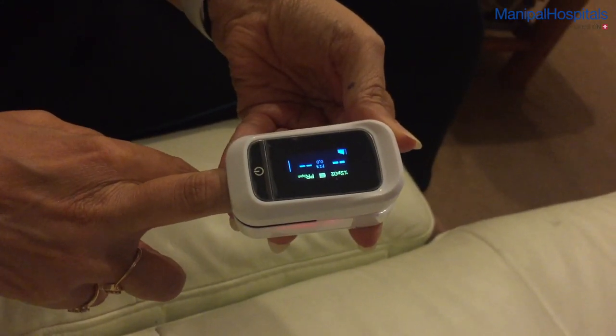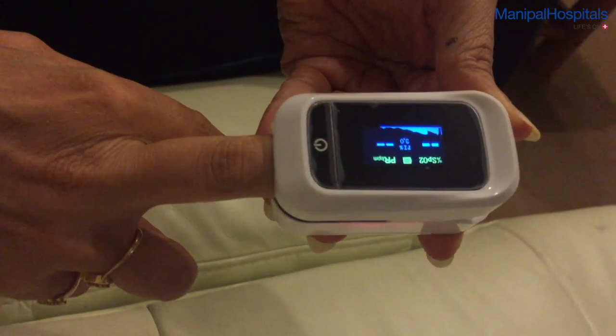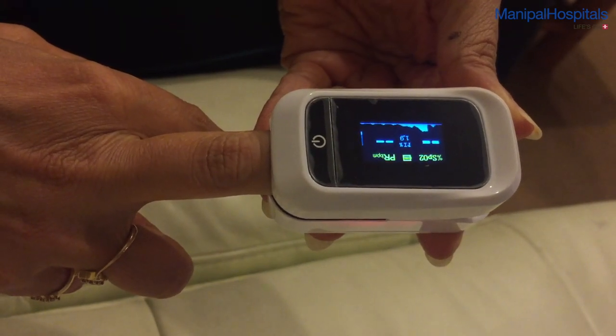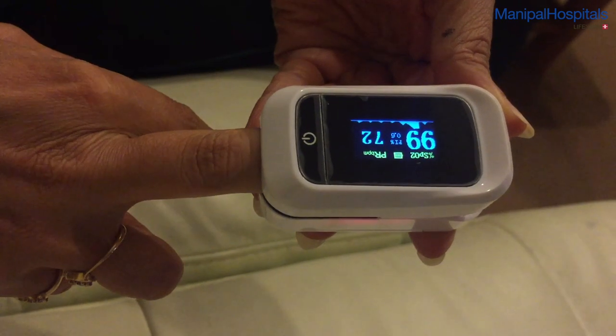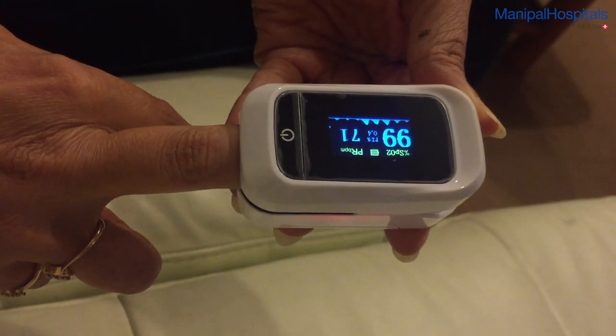Make sure the machine is on, allow it to calibrate, and it will do its reading. There is the oxygen saturation and the pulse rate — simple as that.